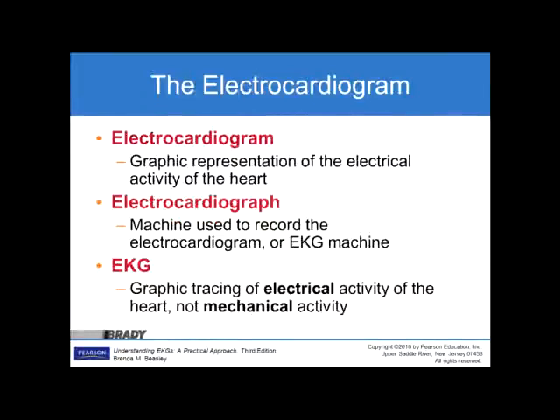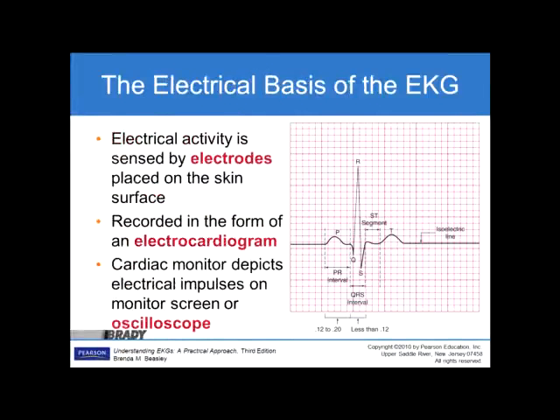One of the rhythms that we're going to learn in ACLS is called pulseless electrical activity, or PEA. So this does not show the mechanical activity, this does not show the cardiac output, it only shows the electrical activity in the heart.